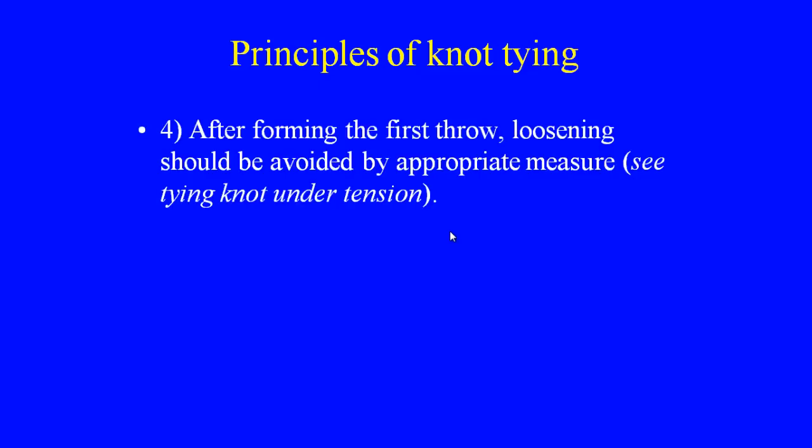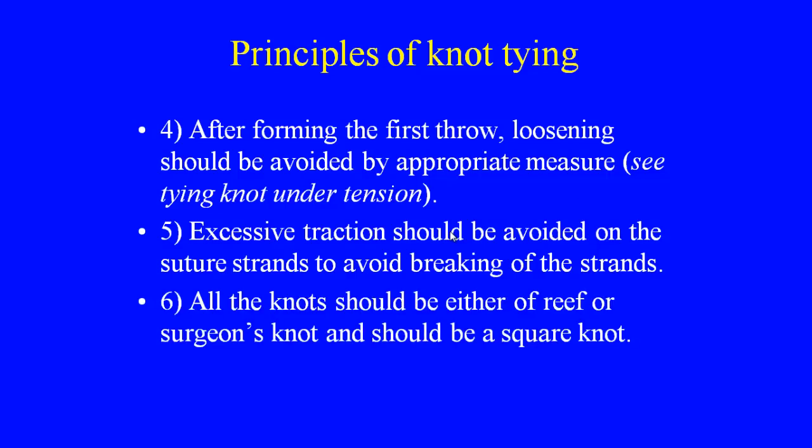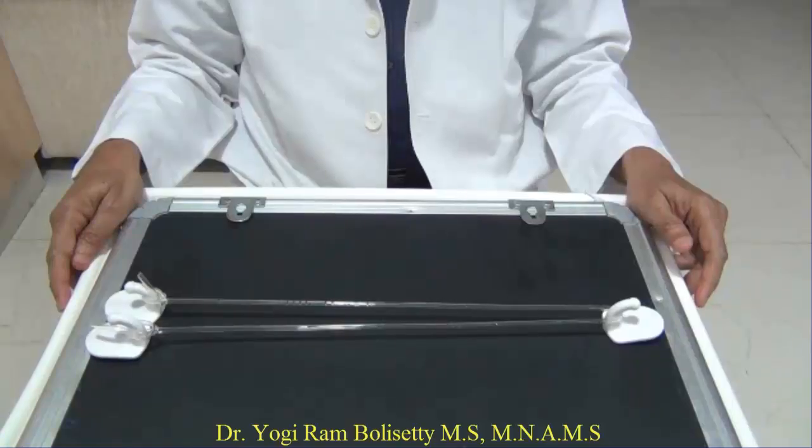After forming the first throw, loosening should be avoided by appropriate measures. Excessive traction should be avoided on the suture strands to avoid breaking of the strands. All the knots should be either of reef or surgeon's knot and should be a square knot.